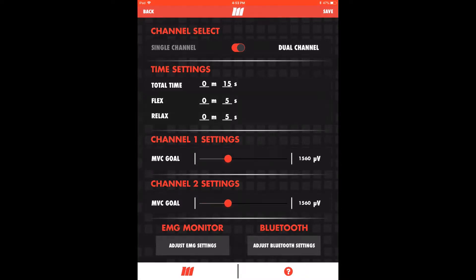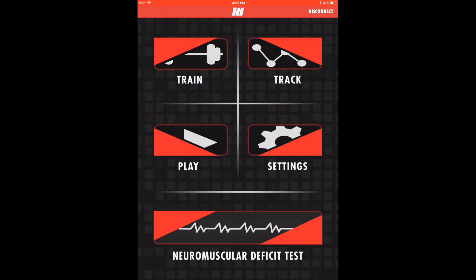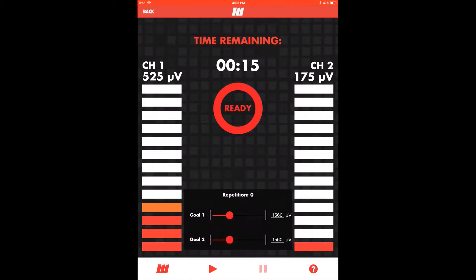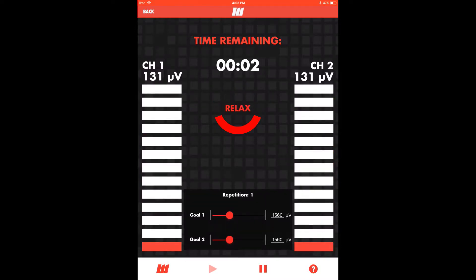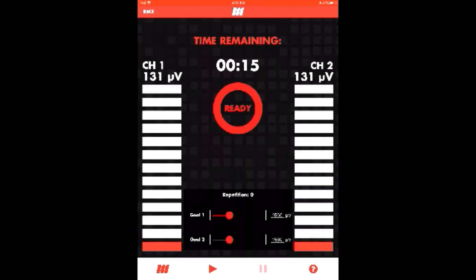Save changes as prompted and return to the train module via the home screen. Flex each channel to test the signal and ensure that channel 1 is connected to the involved side and channel 2 is connected to the healthy side. Press play to begin and follow the prompts. Here we see the contraction of both sides at once and the goal of max voluntary contraction on both channels. This setup may be used during isometrics or bilateral functional drills.